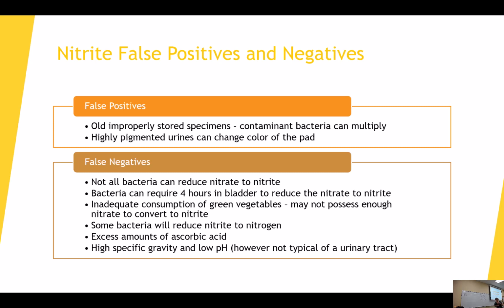Again, it's a light color pad, so any highly pigmented urine is going to change the color of the pad. False negatives. Now this is where things get interesting with these, because remember, this is a screening test for bacteria in particular that can change your nitrates to nitrites.